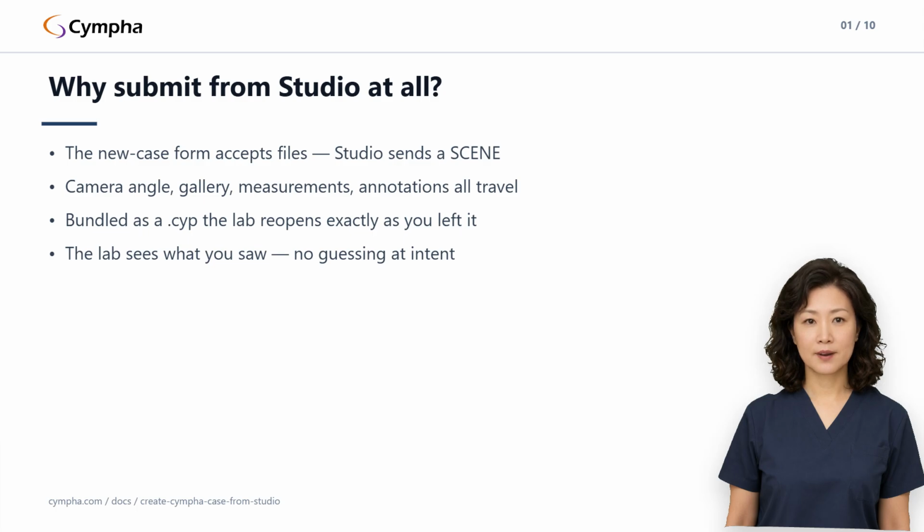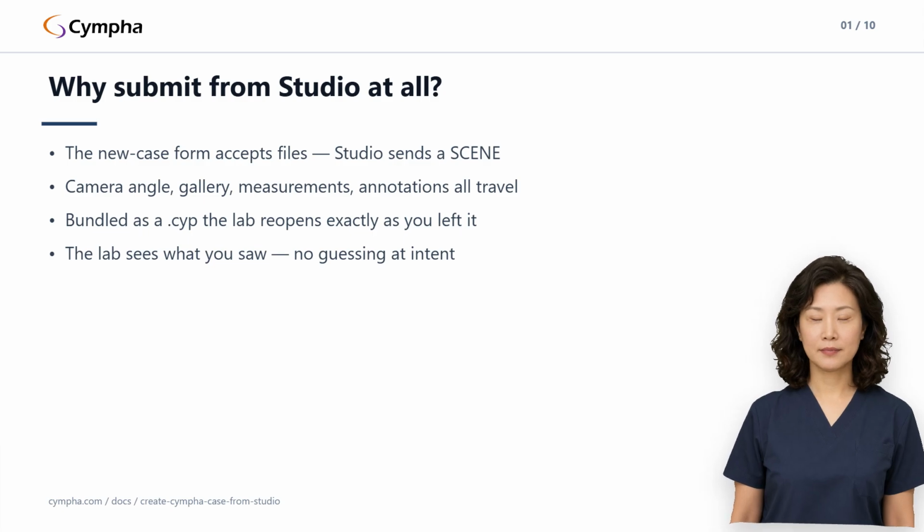If you've done meaningful work in Studio that the lab should inherit, submit from Studio. If all you have is raw scanner output and a photo or two, the direct form is fine, and that from-scratch path has its own guide.